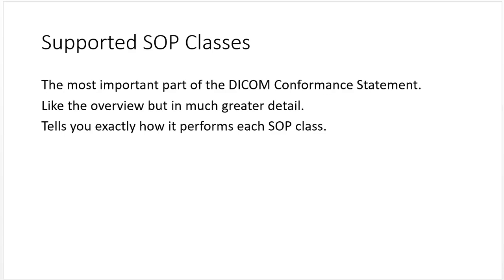So in this section, you get the supported SOP classes. It's kind of like the overview, but in much greater detail, and it tells you exactly how it performs each SOP class.